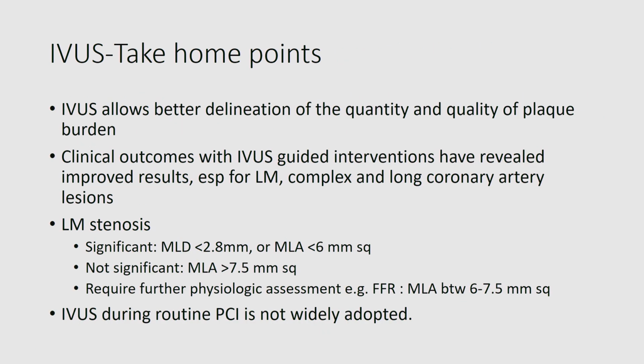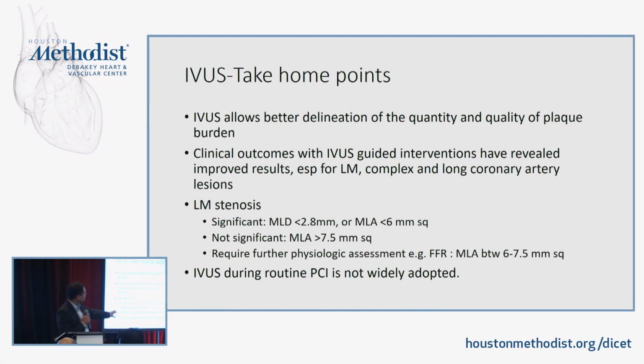So in short, IVUS allows better delineation of quality and quantity of plaque burden. It's used to guide intervention, especially in complex cases. And the luminal area for left main, to remember, is less than 6 millimeters squared.